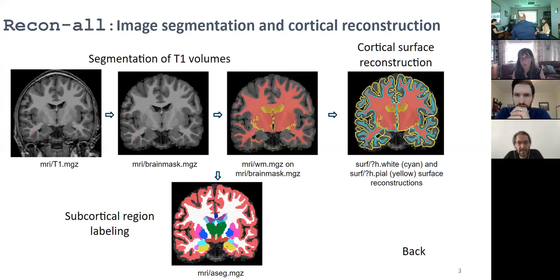Yeah, and I think it is useful to know which is which because some of the files are named, like on this slide, how that one's named aseg, and then some of them are called aseg plus aparc, right, Jason? Yes. Yep. FreeSurfer uses those terms, and just in general, if someone says, "Oh, I do research on image segmentation," what they mean is, typically, using the intensity values in the image to divide the image into different components.